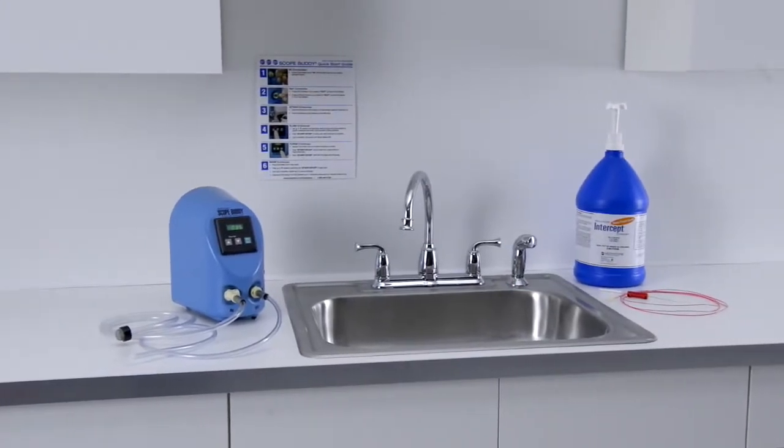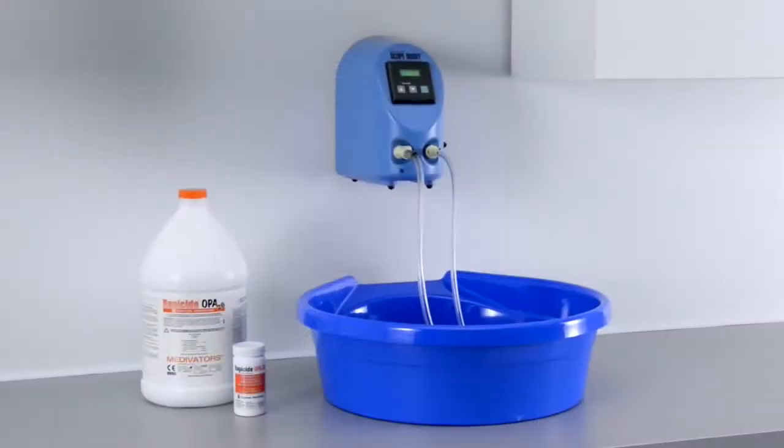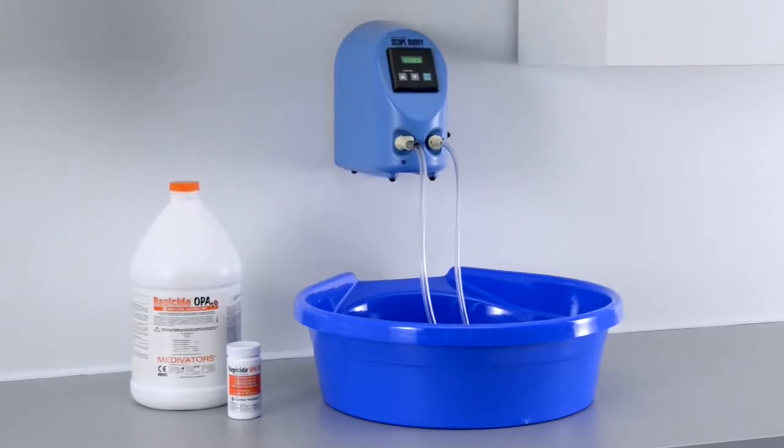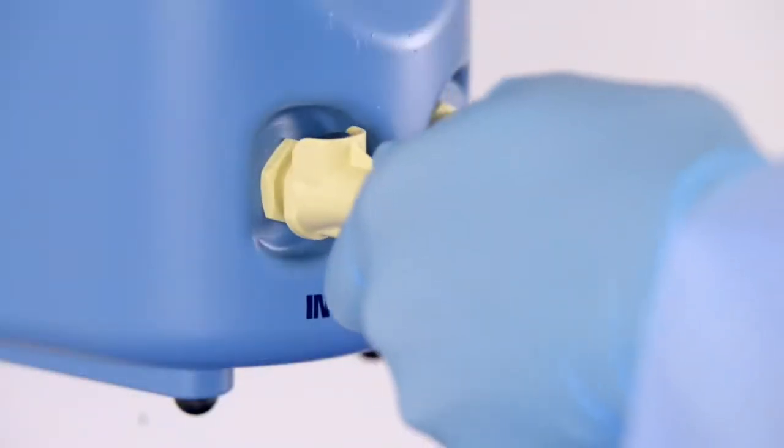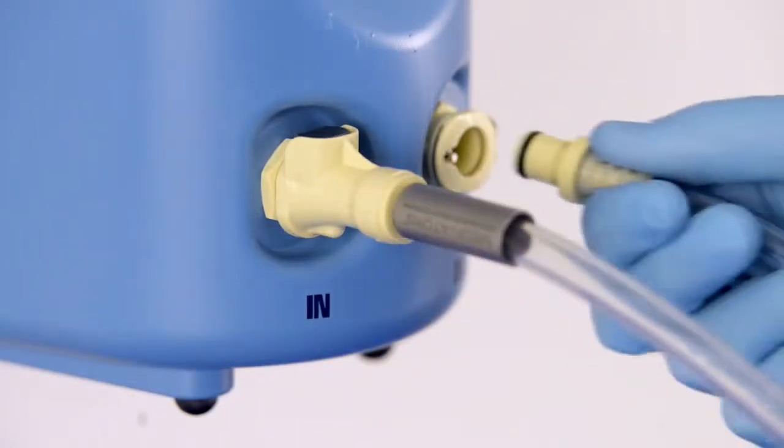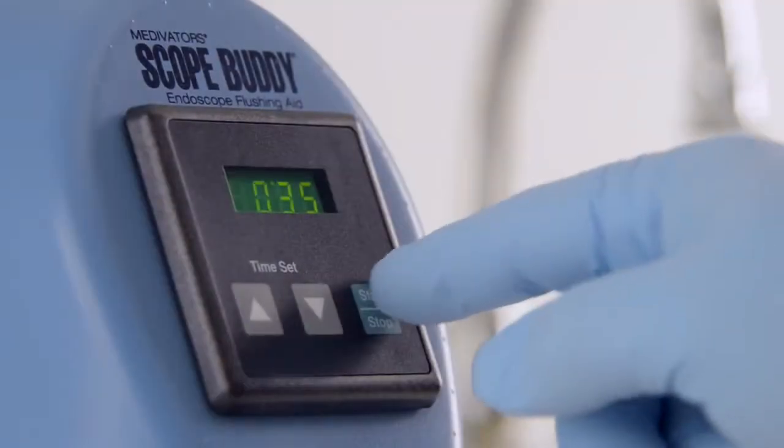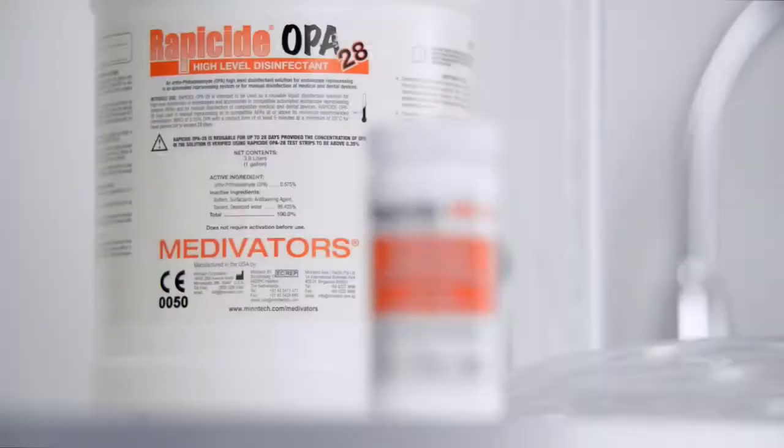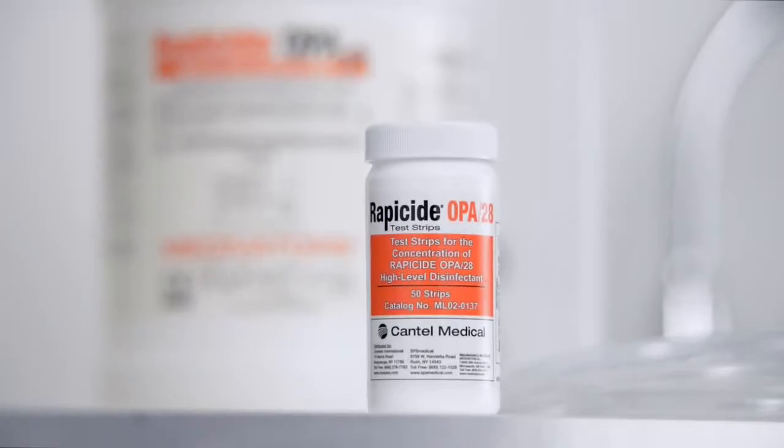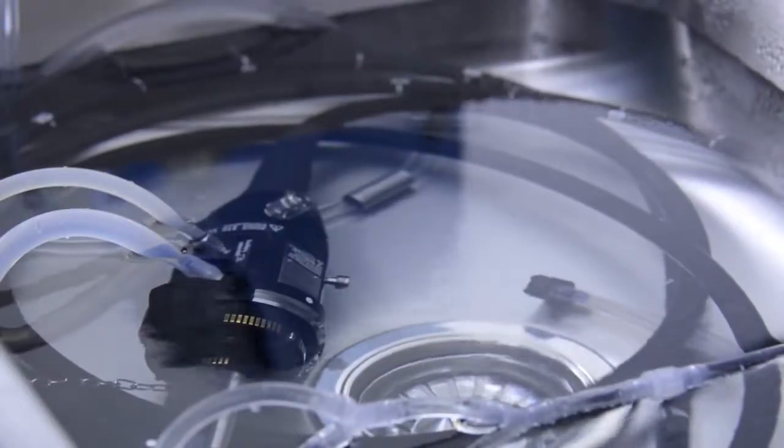ScopeBuddy recirculates fluid through endoscope channels during all steps of reprocessing. By introducing automation into the flushing process, ScopeBuddy eliminates the need for manual syringing during the manual cleaning, high-level disinfection, and rinsing steps of reprocessing flexible endoscopes.